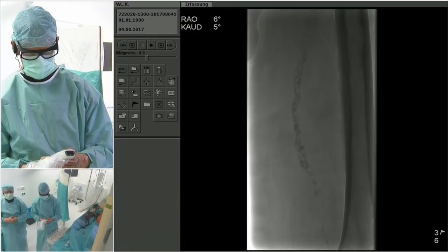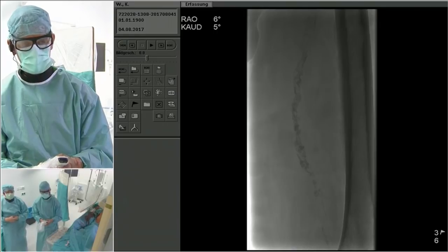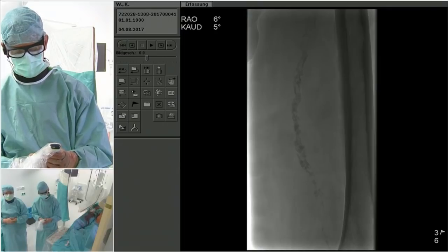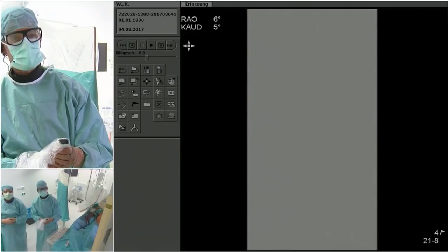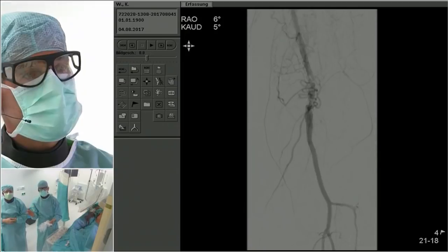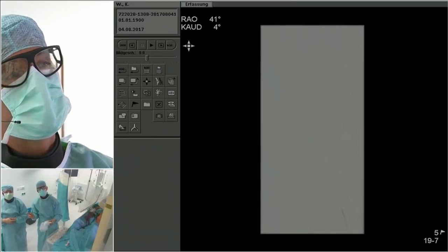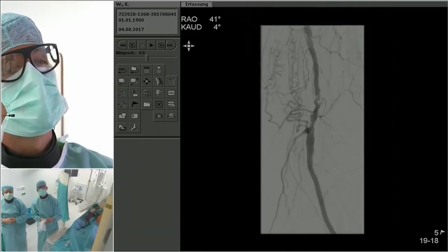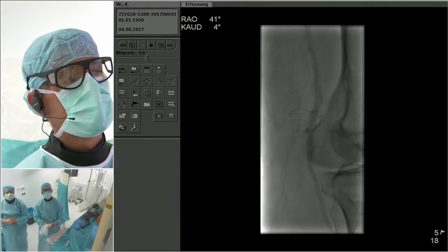I'm going to ask my panelists to weigh in, and let's start from my right and keep going with your preferred approach, briefly in a few minutes. So I really want to see the popliteal before. We want to see the popliteal artery one more time. Mehdi, your approach to this? Here's the popliteal artery, just a moment. You can see there's also maybe a short occlusion or stenosis behind these collaterals. So we did another angulation, and you can see it's a complex stenosis. Based on that, really, I'll go distally because of that large branch. The wire will keep going into the least resistance. That's why I'll go distal, correct.